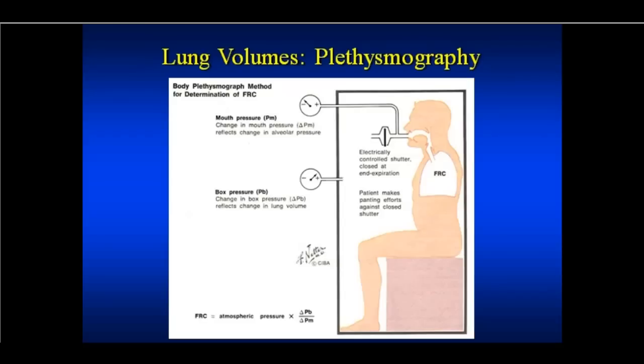Third way, and most common, is the plethysmographic technique, and it works on Boyle's law, and it works only because gas is compressible. If gas were not compressible, we could not do this. All right. The simplistic way to explain this, but the one that makes intuitive sense, is here you are in a box that's totally sealed. You're breathing through a circuit here.